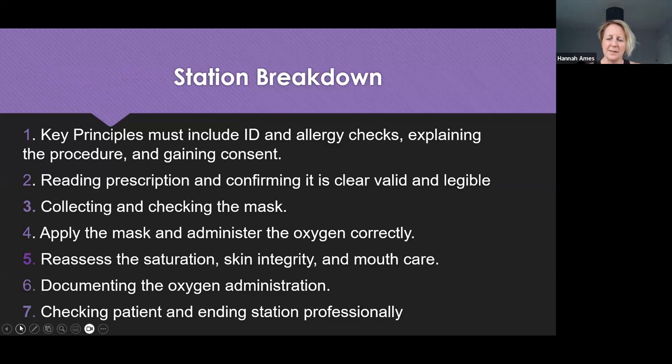Like all my skills videos, when I teach these clinical skills, I try and break the station down into separate parts, so we've got a mental mind map of how we're going to approach the station. I'm going to start with my key principles, and this must include my ID and allergy checks because we are giving a prescribed medication, explaining the procedure and gaining consent. I'm going to read the prescription and confirm that the oxygen prescription is clear, valid and legible. I'm going to collect the correct mask, and there are some checks that we need to do with the mask, which I'm going to show you.